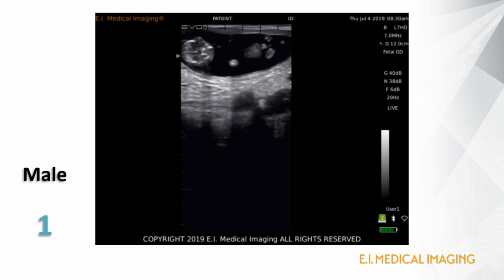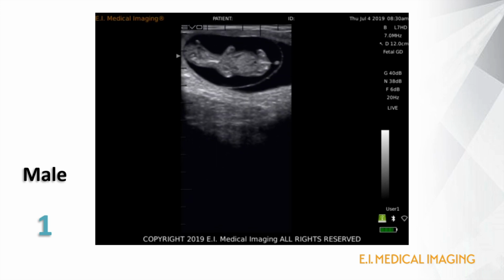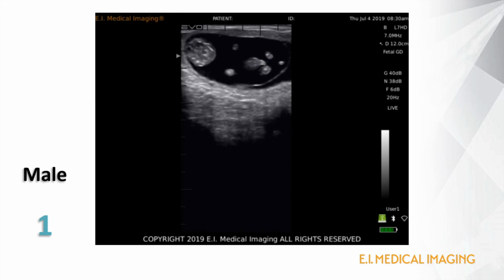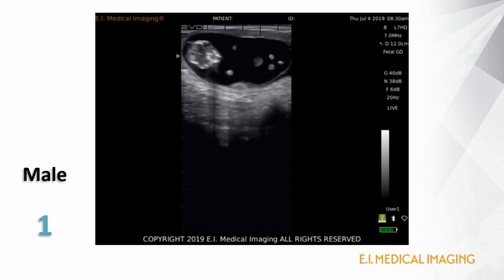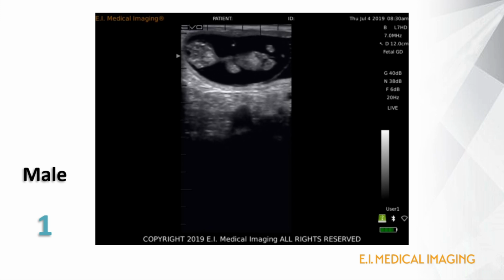We can clearly see the cross-section of the umbilicus with the bright white male GT just caudal to it. We can also see a cross-section through the 4 limbs and tail and the amnion encircling the fetus. This is a bull calf.